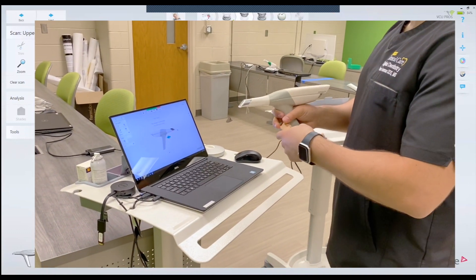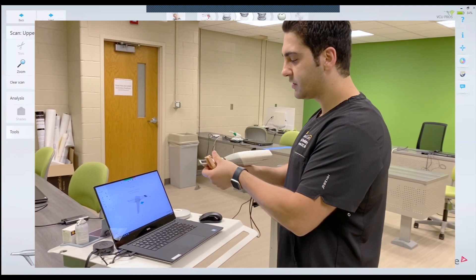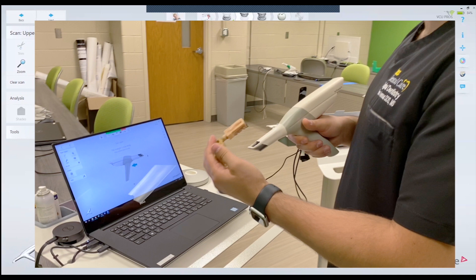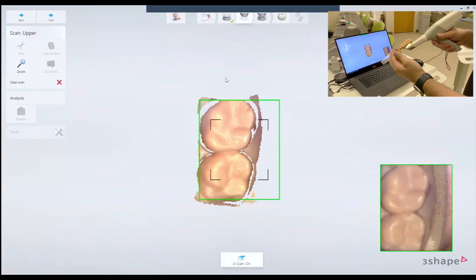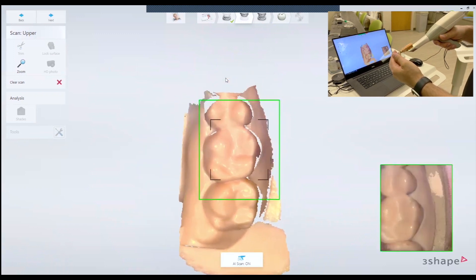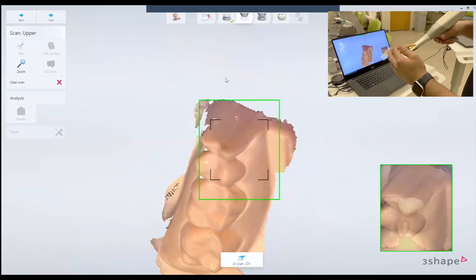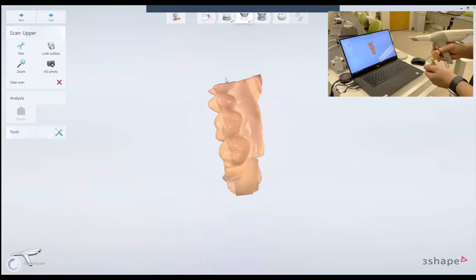When you are on the next page, if you're scanning a patient, you'll switch the tip like this and you're going to be scanning the upper like this. So I'm going to be scanning the upper the same way as if you're doing it in the clinic, and we have the upper scan.